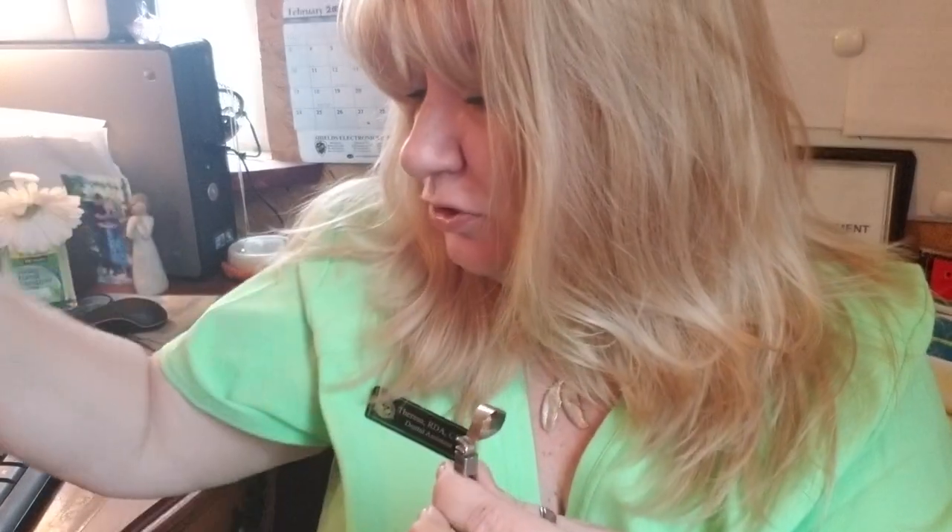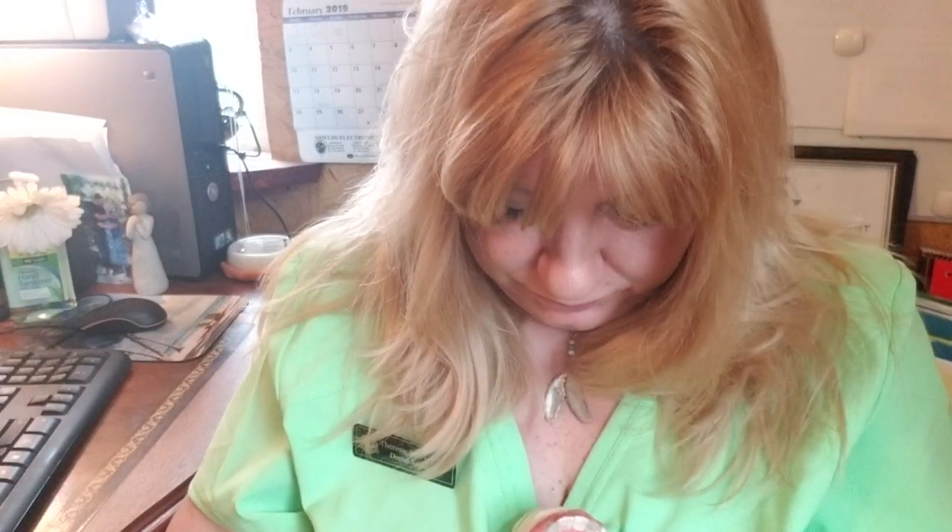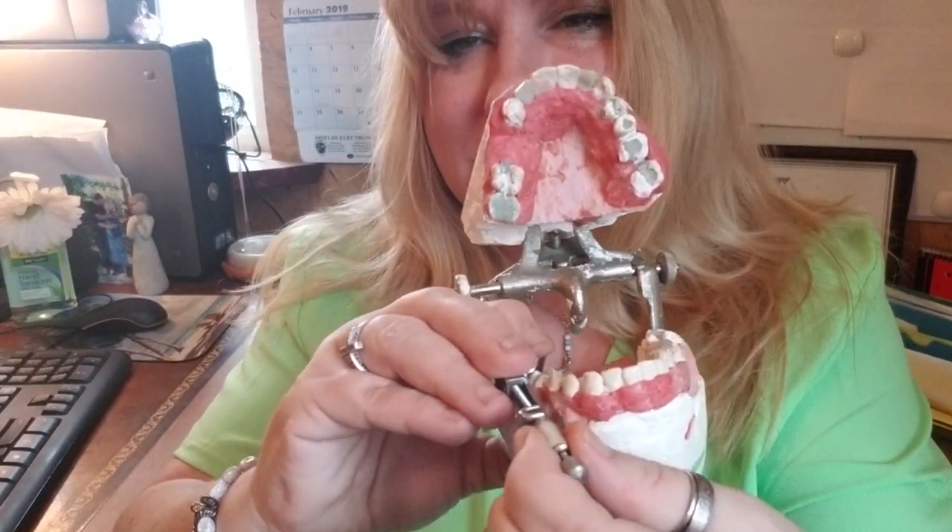Once you have this ready, some doctors will let their assistants place it — it saves time. We don't do a lot of amalgam fillings that need it anymore, but occasionally you'll need it due to insurance. Once you have it on the tooth, wrap it like a ring, then tighten the inner knob and it's going to start to hug the tooth.